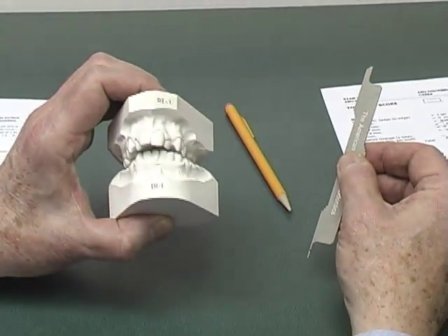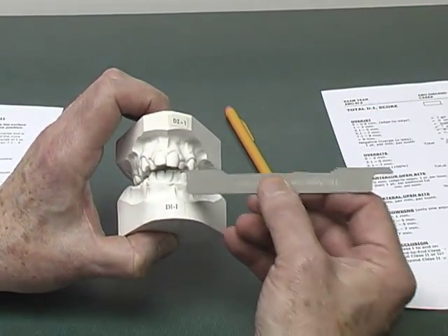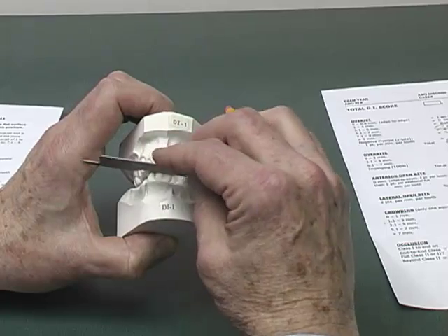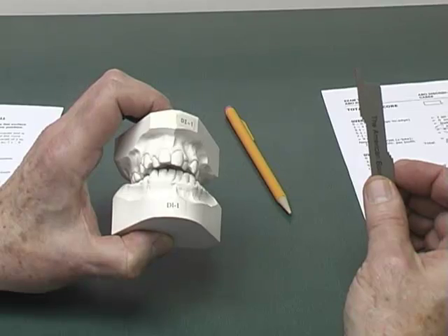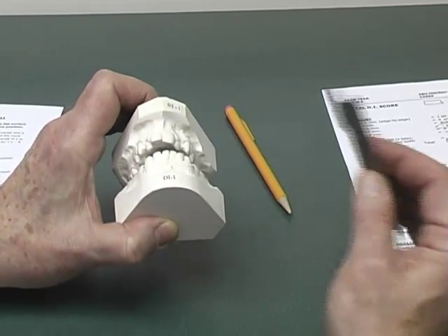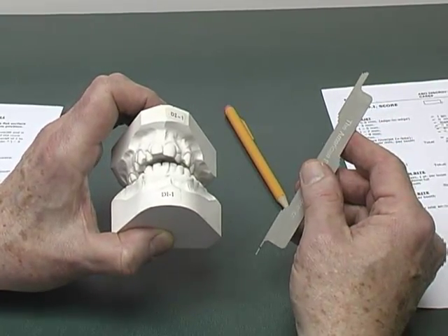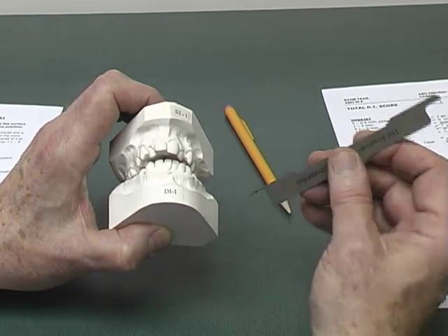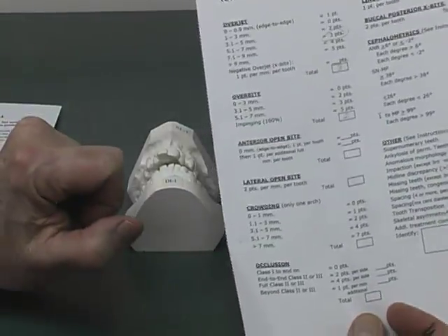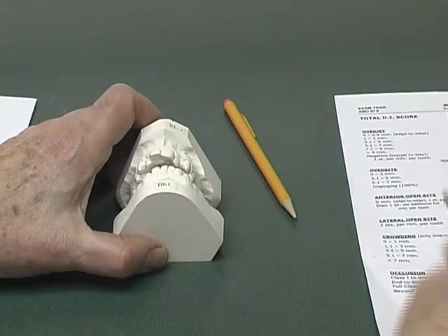When we view the vertical relationship of the incisors, they are end-to-end for all four incisors. Even though there is a severe openbite relative to the palate, this DI form is concerned with the relationship of the teeth only. So the four maxillary incisor teeth are scored as four points on the DI — zero overbite means edge-to-edge, one point, four teeth, four points.